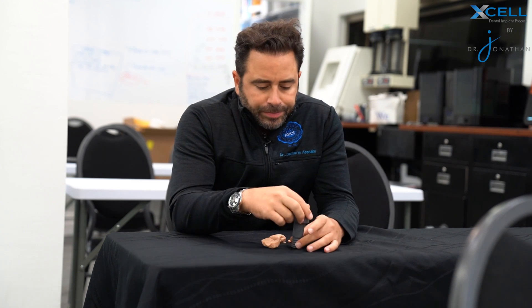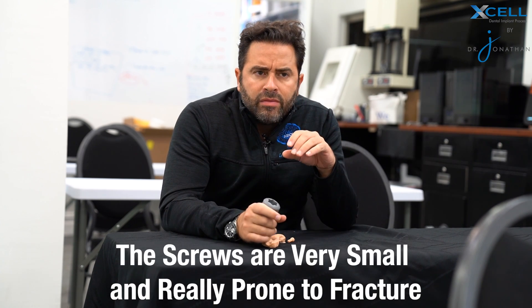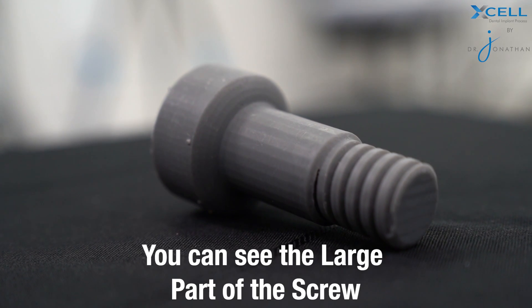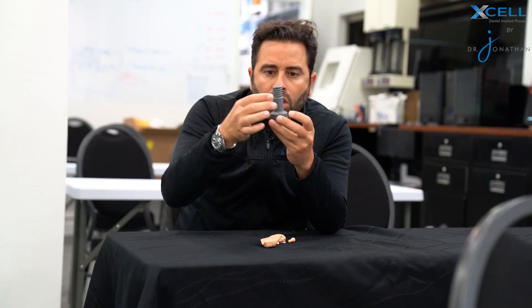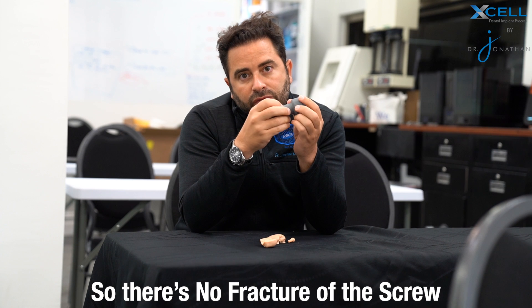The other issue we've always had with multi-unit screws is that they're very small and very prone to fracture. Because of the way the Powerball screw is created, you can see this large part of the screw — when the patient bites down into the prosthesis, instead of the forces being pushed around the actual thread, all of the force is in the thick section of the screw so that we don't have any fracture of the screw.